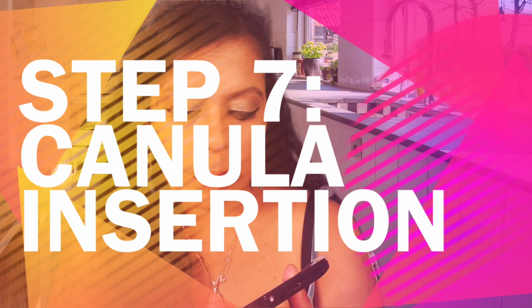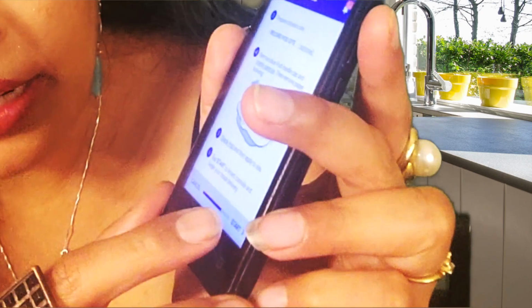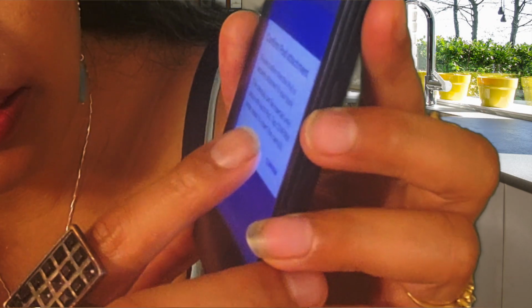All I need to do is go back to the PDM where it says prepare infusion site. I've just done that. I've applied the pod on a site of my choice. Okay, so now I just hit start and I have to hit confirm. Okay, you'll get a message communicating with pod. And you'll feel, did you hear that sound? You'll feel the cannula get inserted. You'll feel like a tiny little prick, and then you get a message. Is the cannula properly inserted? If you felt the cannula entering you, you hit yes, and then you will get a message saying your pod setup is complete and whatever basal program you have going on is active.